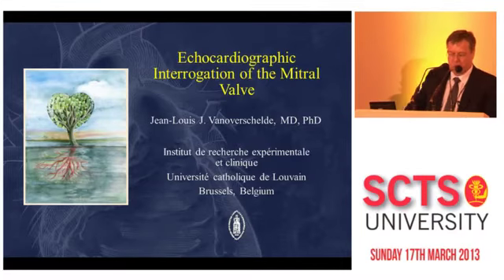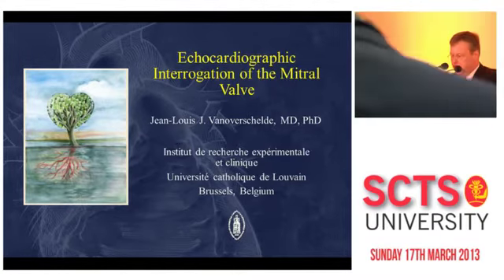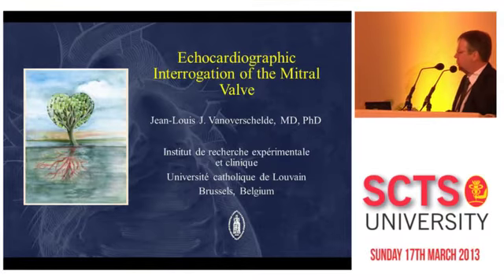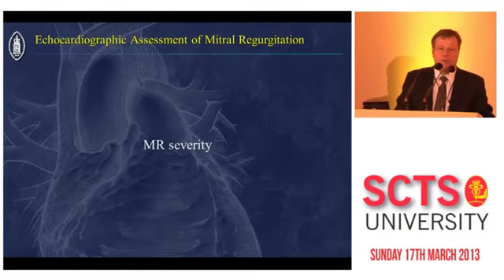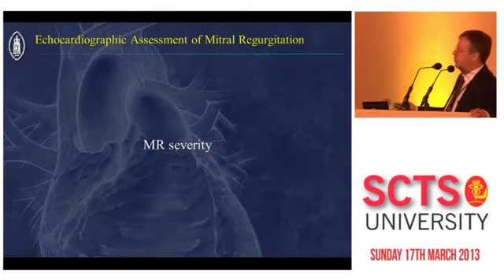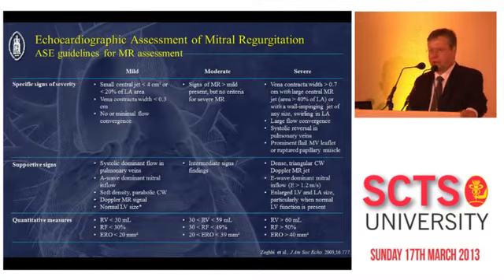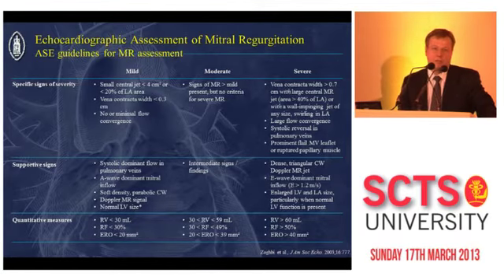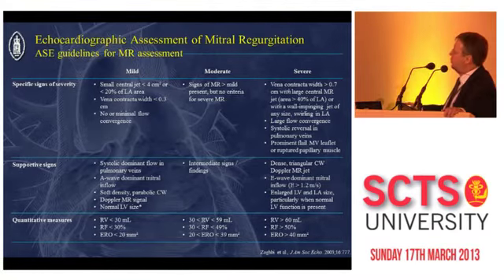So what I'm going to do in the next 15-20 minutes is give you an overview of how we assess the mitral valve. There are a lot of things that we do when we assess the mitral valve. The first thing, of course, is to define whether or not we are dealing with severe mitral regurgitation. I'm not going to go into the details of this because this would be an entire talk on this assessment. Just to tell you that this assessment is complicated, it's difficult, and it needs to be done by a combination of several items that you will acquire during your echo session.